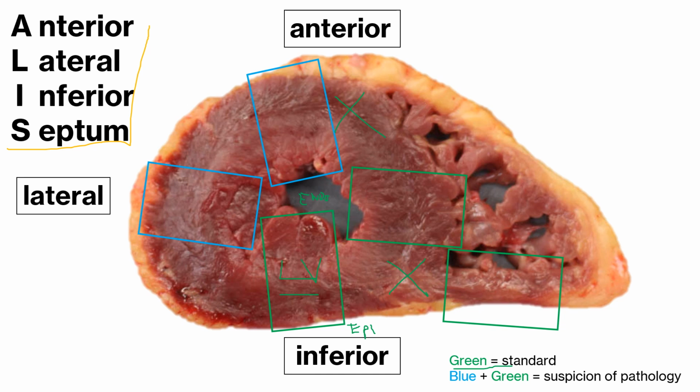And lastly, our right ventricle, always, always, always taking it from the anterior aspect because of how fatty replaced the anterior aspect gets. So you can take a longer section of this because you'll want to thin it out lengthwise. Because again, we want to see epi to endo.